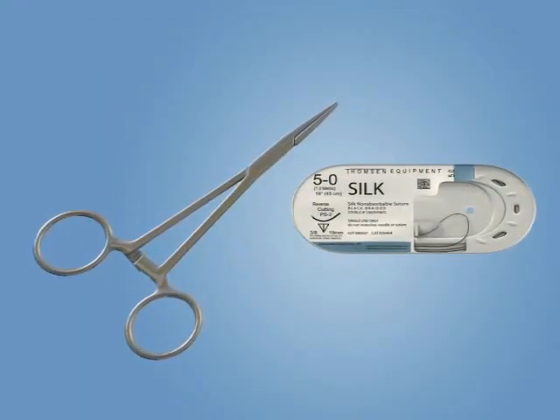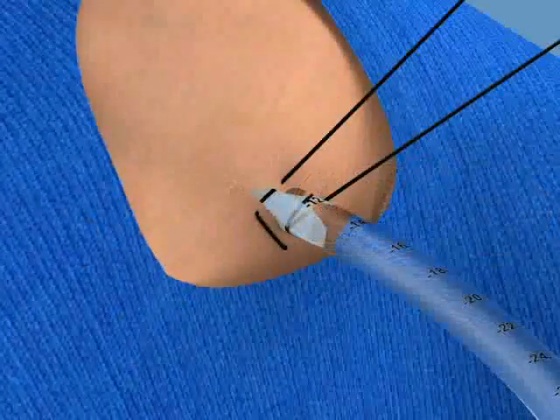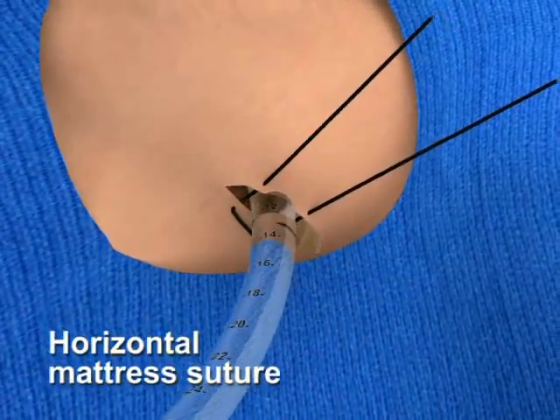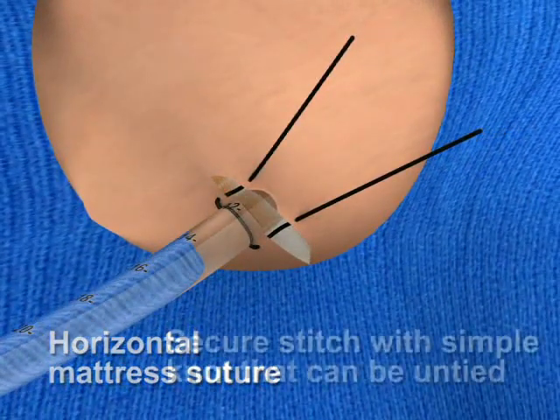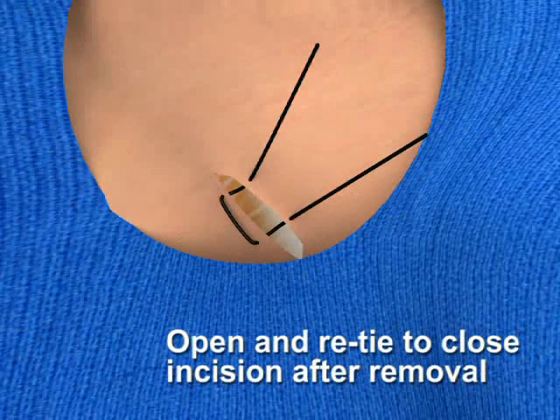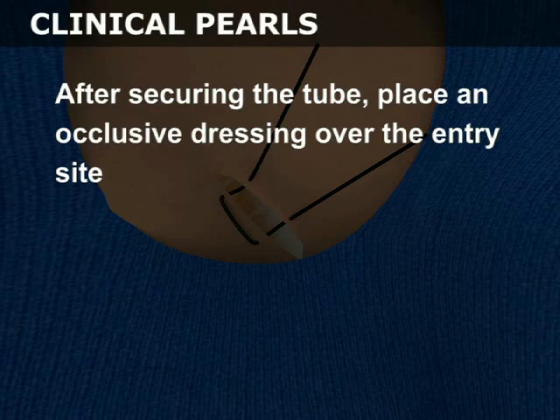Various methods of securing the tube are available and local institutional protocol should be followed. One practical method includes placing a horizontal mattress suture one centimeter across the incision on either side of the tube. Secure this stitch with a simple knot that can be untied so that it can be opened and re-tied to close the incision after the tube is removed. After securing the tube, place an occlusive dressing over the entry site.